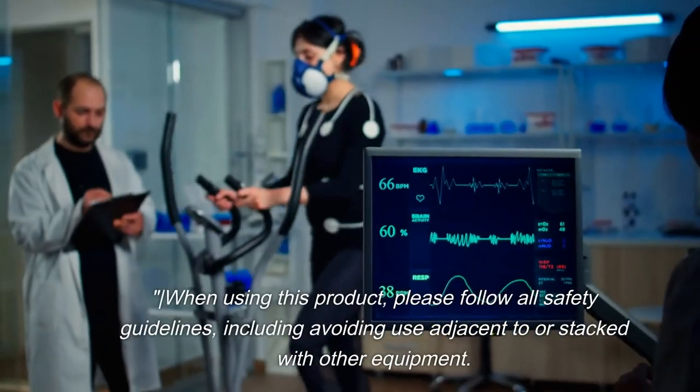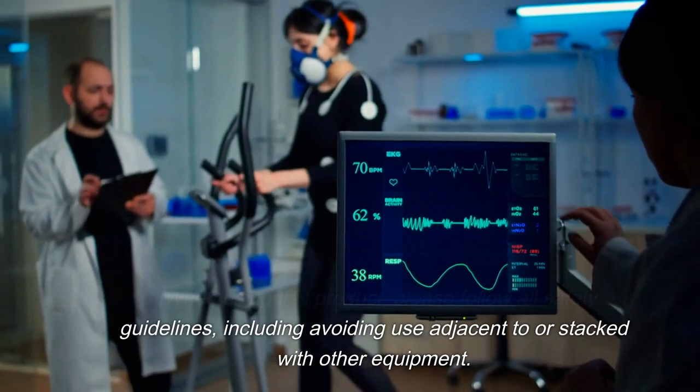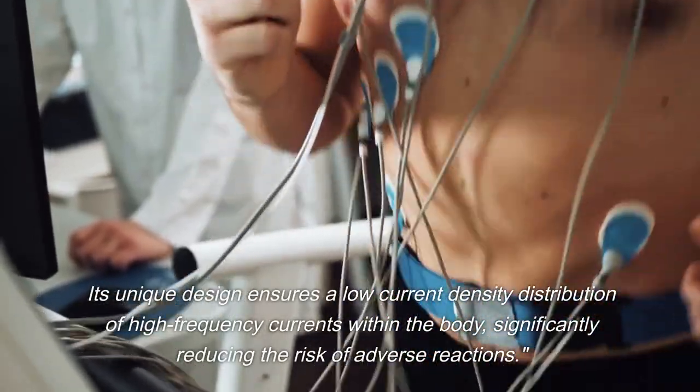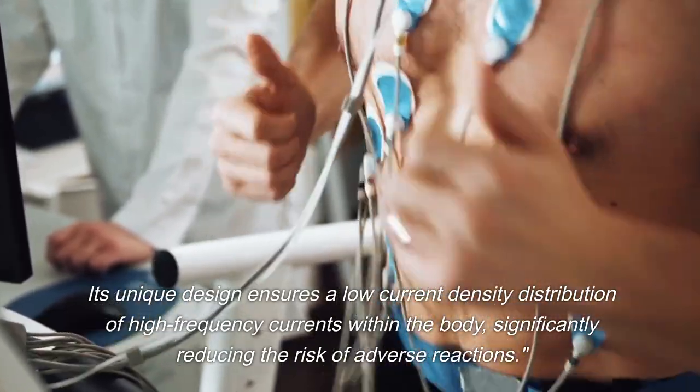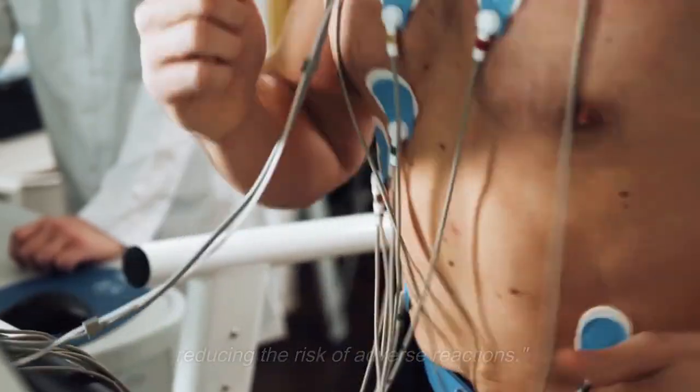When using this product, please follow all safety guidelines, including avoiding use adjacent to or stacked with other equipment. Its unique design ensures a low current density distribution of high frequency currents within the body, significantly reducing the risk of adverse reactions.